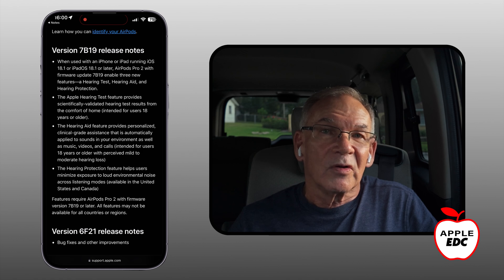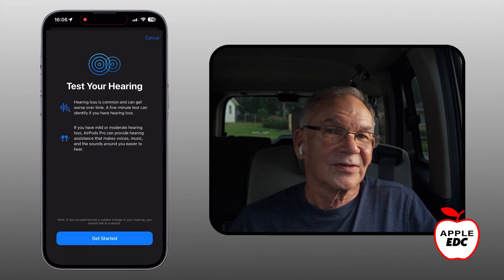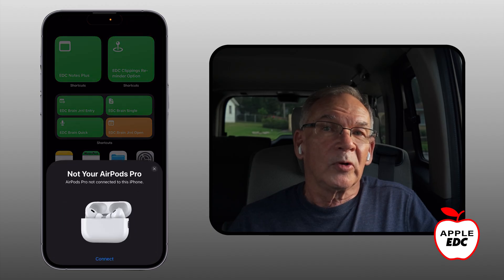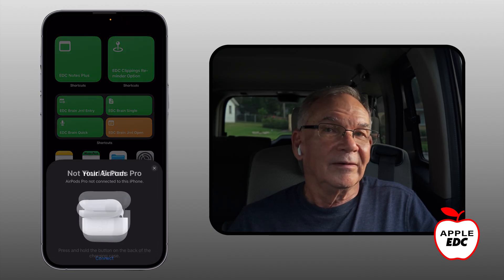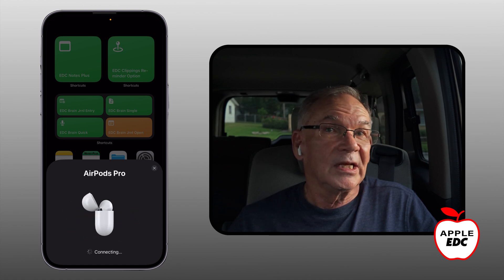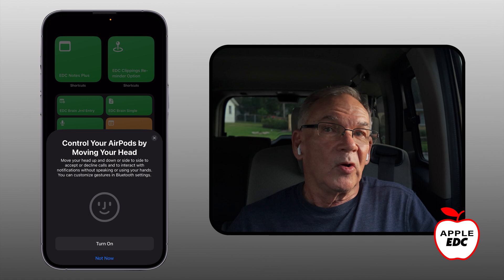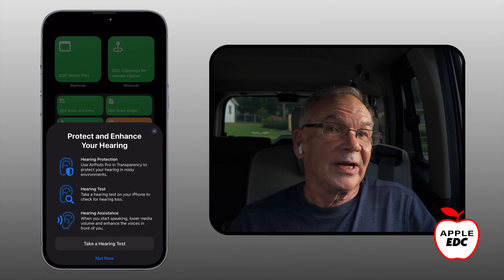If you already have AirPods Pro 2 earphones paired with your phone, once you've updated to iOS 18.1, place them in your ears or open the case next to your phone. Then go to settings and find your AirPods, click on the right arrow and select 'Take the Hearing Test.' If your AirPods Pro 2s are new, hold your AirPods Pro case next to your phone and open the lid. You should see a picture on the screen. Hold the button on the back of the case, then you'll see the different options displayed. For this demo, I just decided to set them all up later. Now I'm ready to take my hearing test.